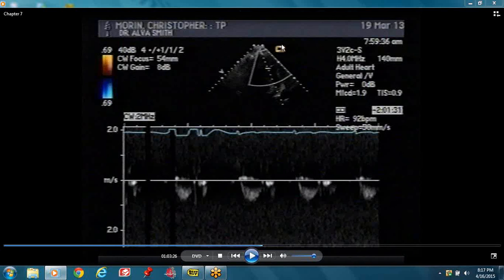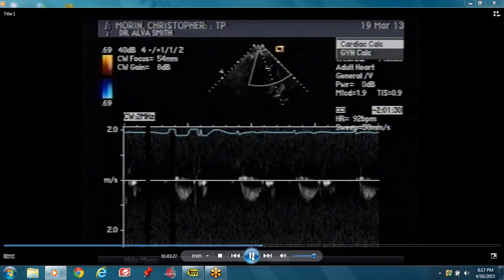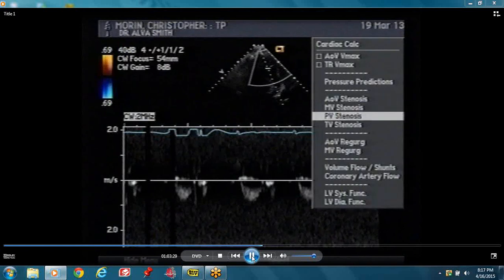The transducer is denoted by this little box. The flow is actually moving away from the transducer, that's why it's below the baseline. That's your normal ejection across the pulmonary valve.